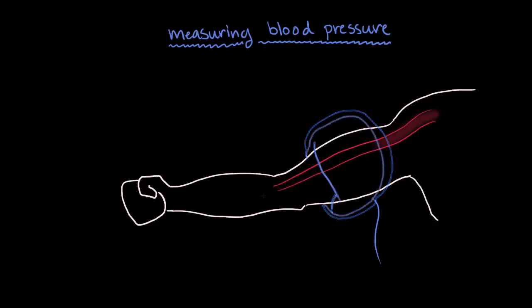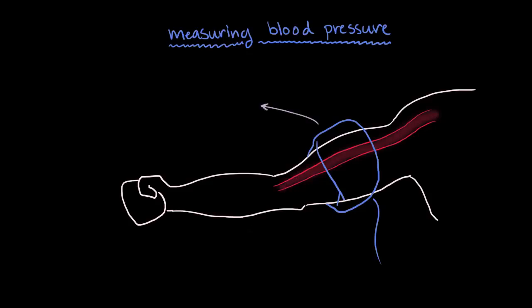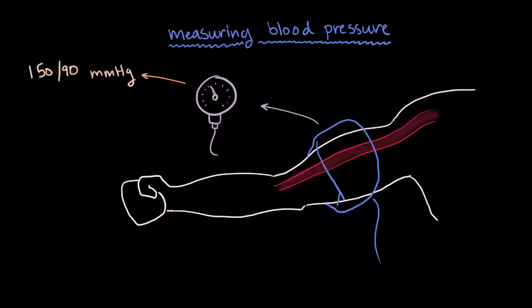Then as it slowly deflates again, they can measure at what point your blood pressure is enough to start pushing blood through the vessels again. As this happens, the cuff will be attached to this gauge, right, that tells them the pressure reading in millimeters of mercury. They'll then use this number to figure out where in the spectrum of hypertension you would fall, whether it's normal or pre-hypertension, stage 1 or stage 2.